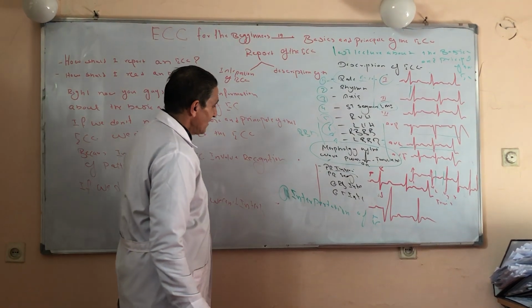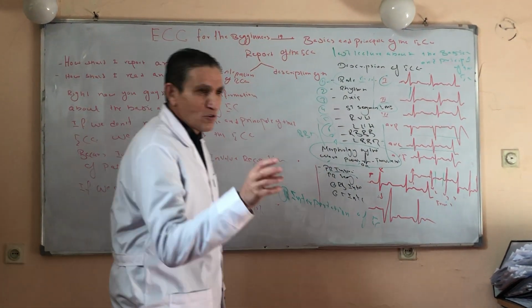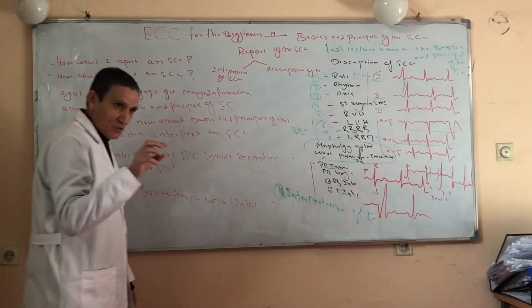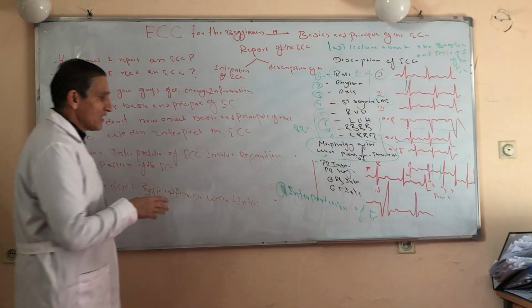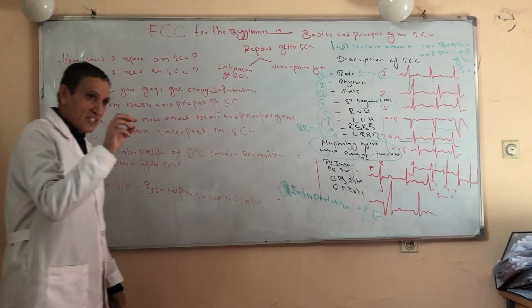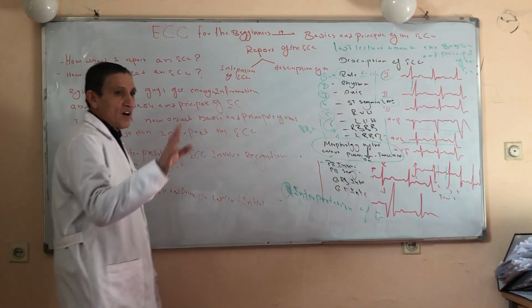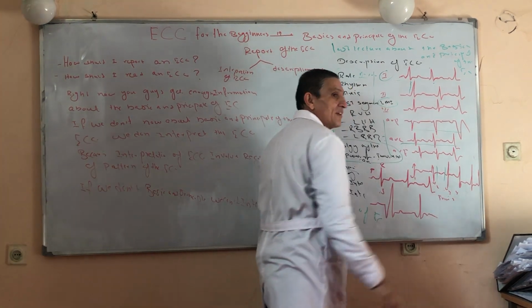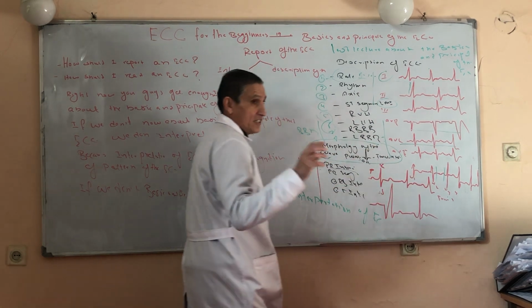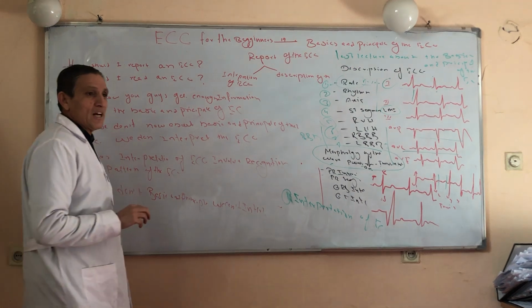Another is interpretation of the ECG. What does it mean? After the description of the ECG, if you have found any abnormality, under the topic of interpretation you should think more about the underlying pathological condition. If the ECG is normal, you should give a normal report. If you have got any abnormal finding, we should focus on that finding to find the underlying cause of the pathological condition. And after that, you should immediately draw the 12 standard ECG leads. If you draw these 12 standard ECG leads, then it means you have got information about the ECG, or you know more or less about the ECG.